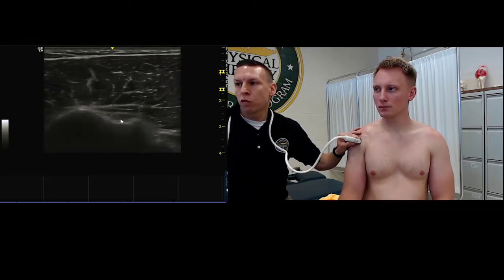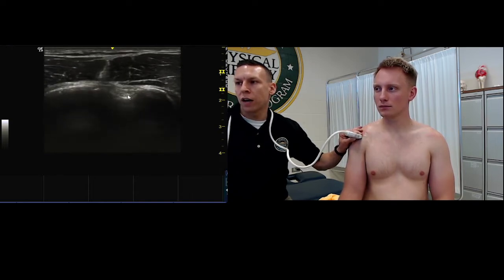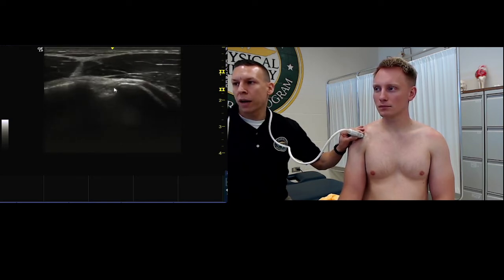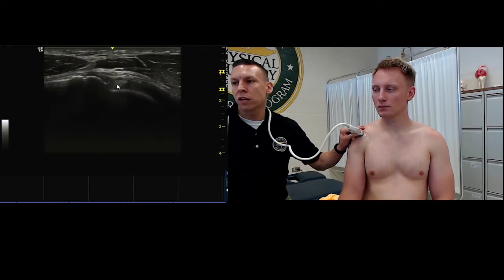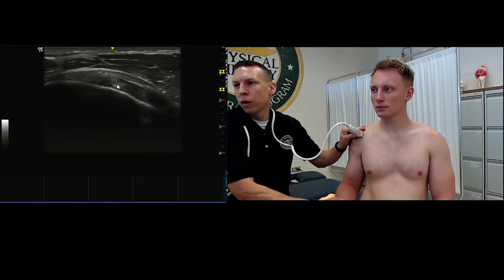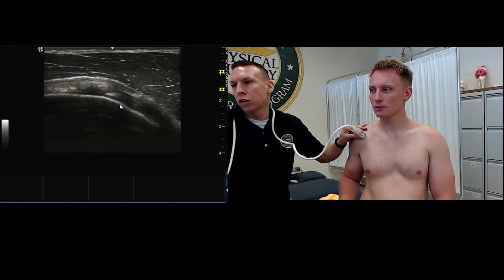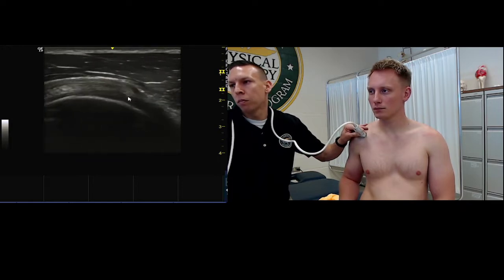Then we're going to move our probe back up and make sure you can continue to find the long head of the biceps in short axis. And we're going to be right back in this groove. You can keep coming up out of the groove to visualize the long head of the biceps as far up as you can go. You can even move their shoulder into a little bit of extension. You can see I have to move my probe, and as you do that, it's going to move on you. It's right here, and this is around the rotator cuff interval. And you can keep moving your probe.